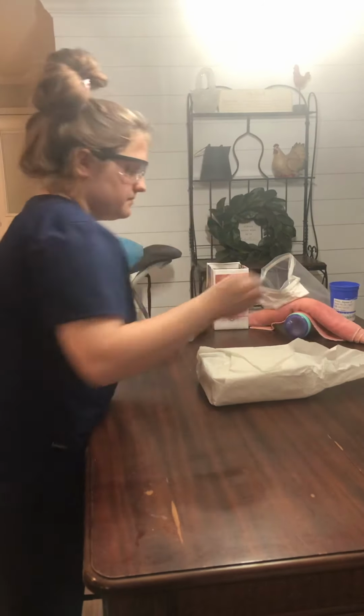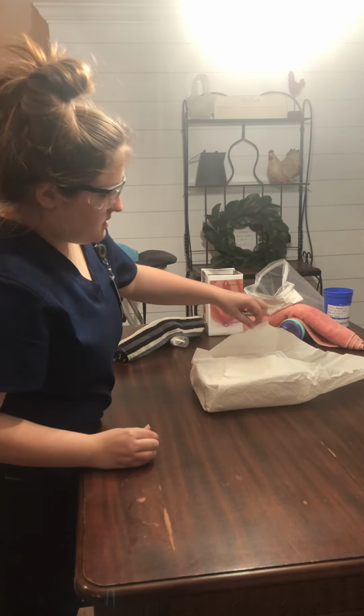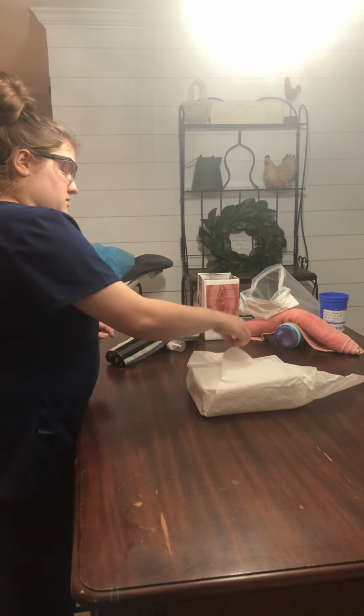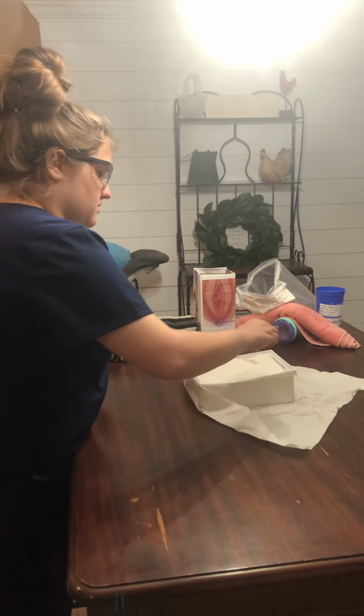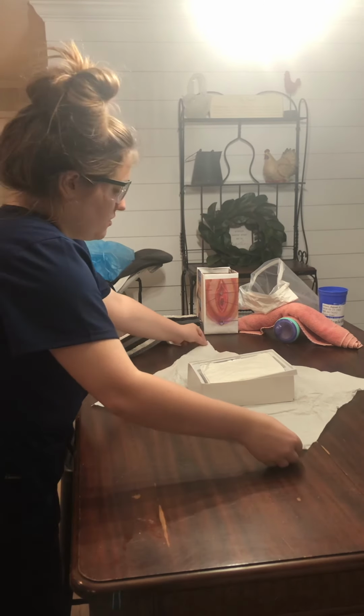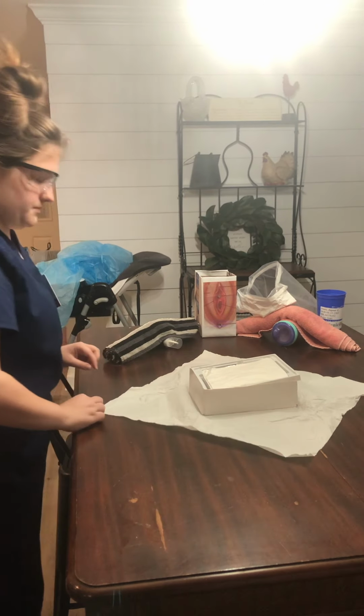Okay, so I'm just going to open the outside. Now I'm going to don my sterile gloves.